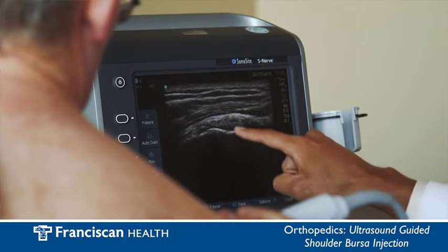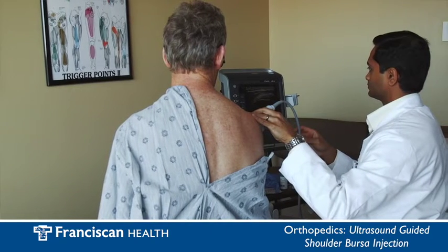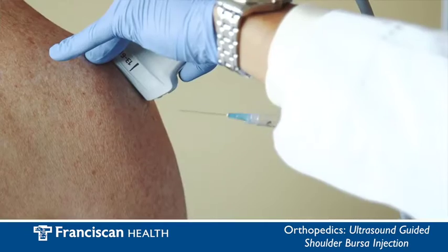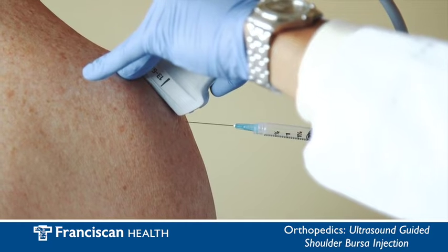Ultrasound is a medical tool that uses high-frequency sound waves to capture live images from inside your body that can be used for diagnosing various medical conditions as well as helping to accurately guide and place a needle in the body for injections, drainage, or catheter placement. For today's demonstration I will be using it for needle placement.